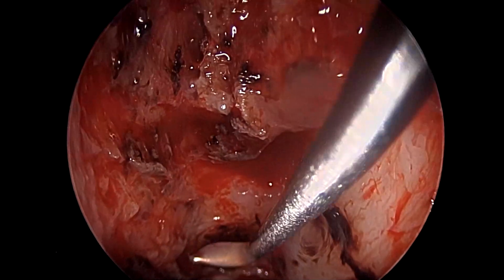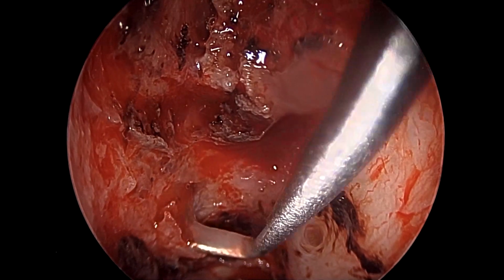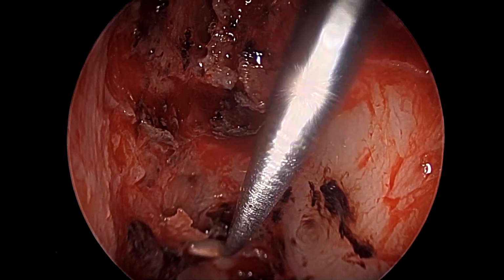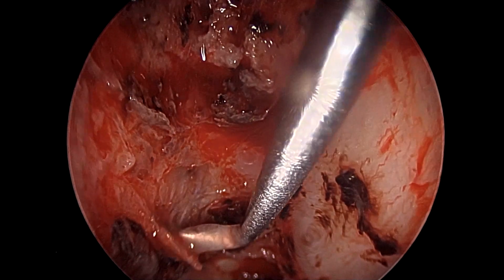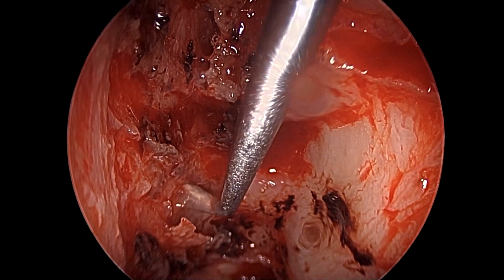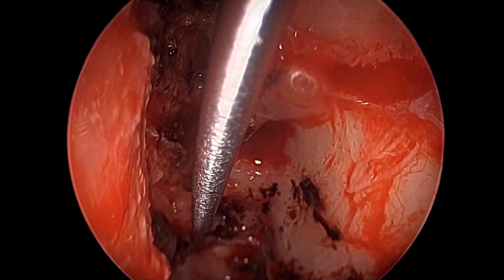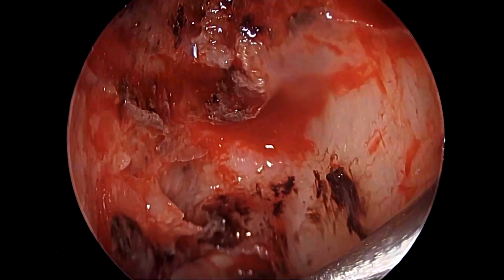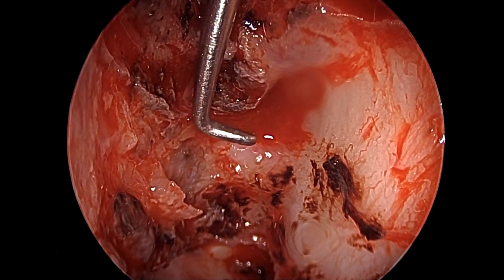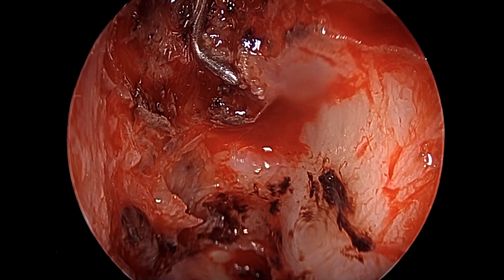And for this we could use various kinds of angled elevators to work on the skull base, like we are doing in this patient. And the point is to remove some bone. One must never be scared of removing excess bone, because it really does not matter as long as you have adequate exposure and 2 layers of fascia, which is inlay, you can say, and onlay. These defects are almost always closed unless there are other factors that could hinder them. So one must be very generous in removing some bone around the skull base defect area to create more space.